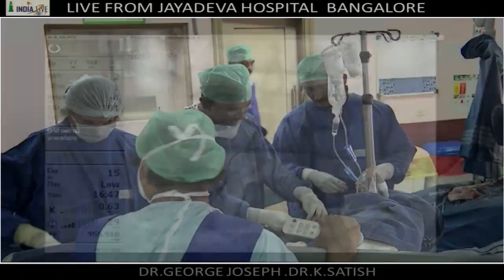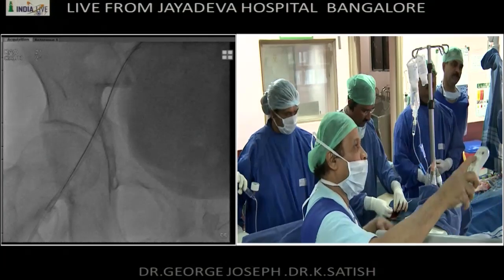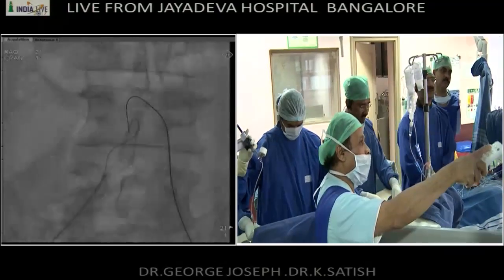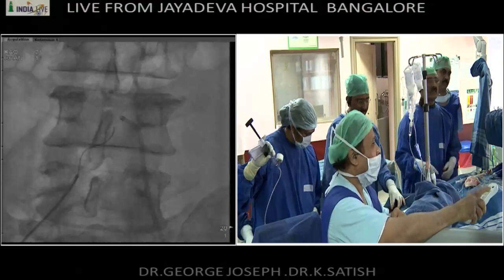Okay. So, Dr. George, we are back to you. Hello. We'd like to know how far you have progressed with your case. Yeah, okay, sure. Can we go back? Can you go back? Okay, we'll take you back to where we were. Okay, we were here.